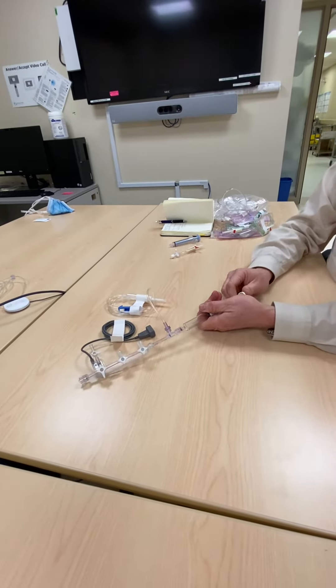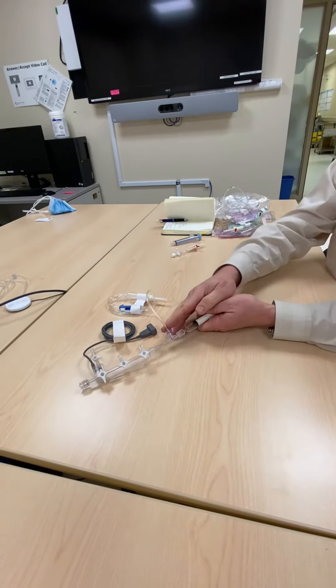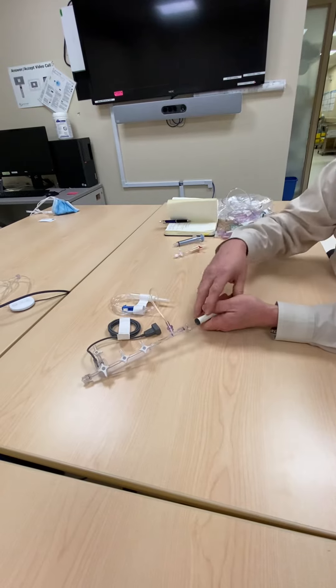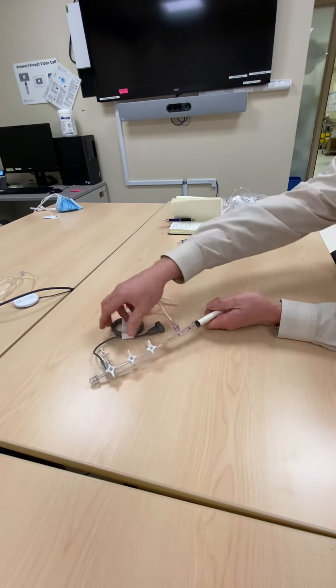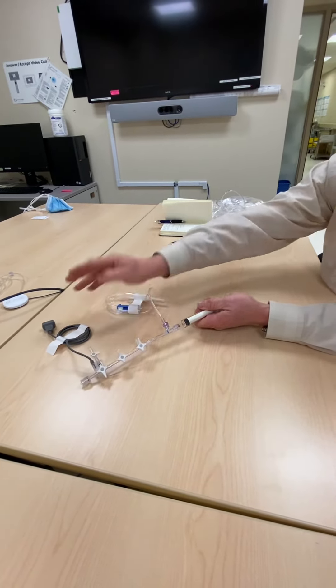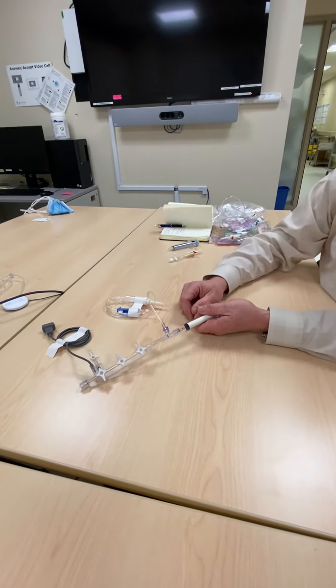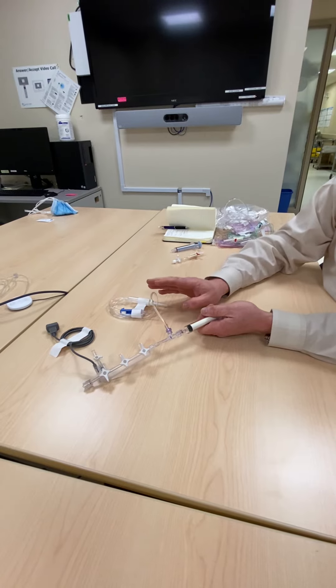And then when I inject, the valve will close and open up this way. And whatever I inject is going into the patient. You'll lose your pressure line for just a few seconds while you're injecting, just during the injection.